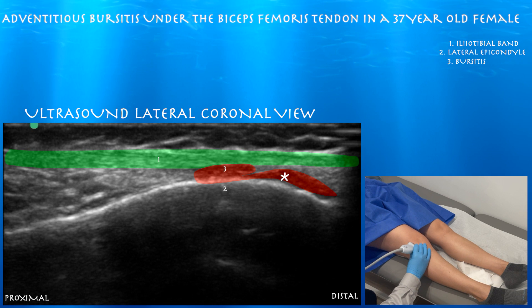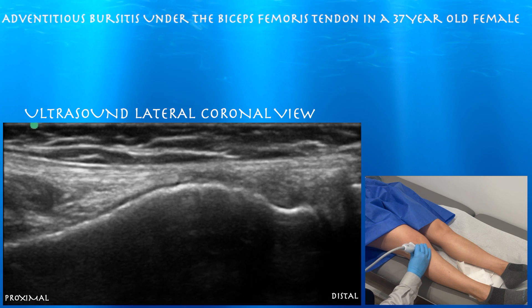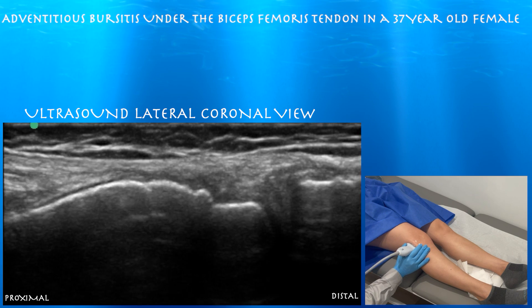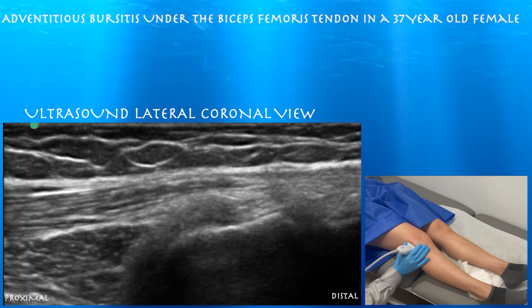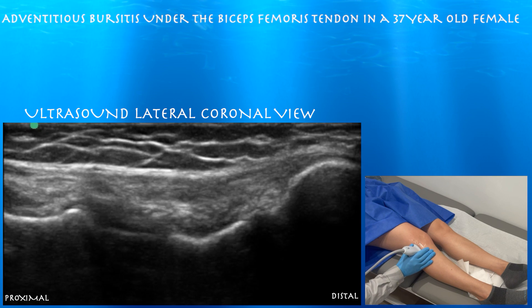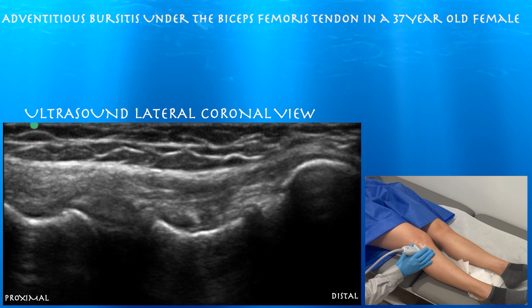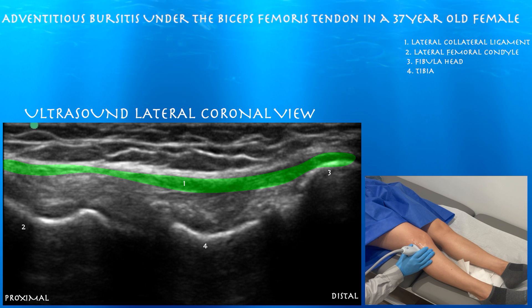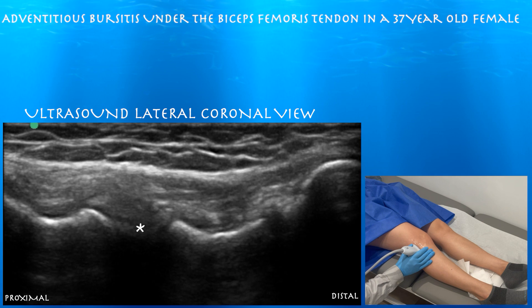Here you can appreciate a little bit of bursitis underneath the ITB band. This is a pretty normal view. You can look at the lateral collateral ligament, which is a long, kind of lax ligament going from the lateral epicondyle all the way down towards the fibula head. You can see the joint line here — looks like she has a good joint space.